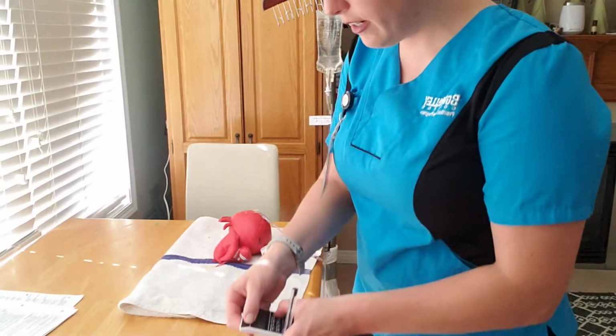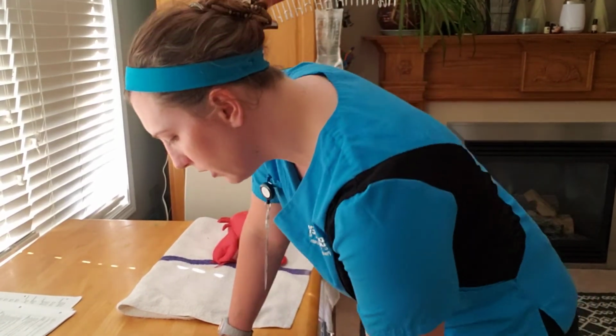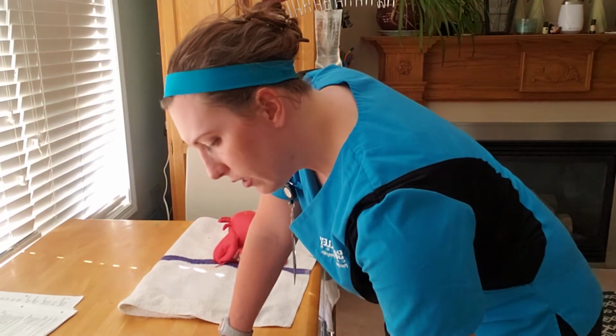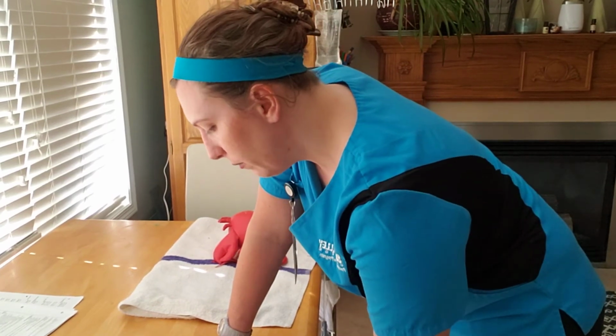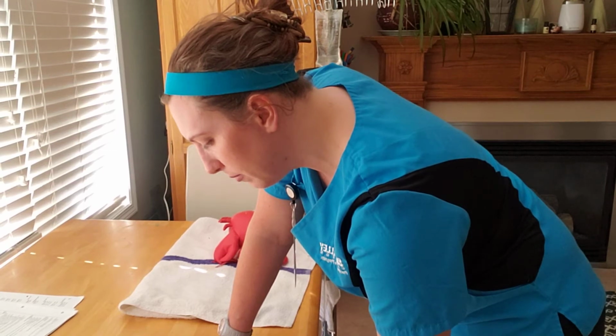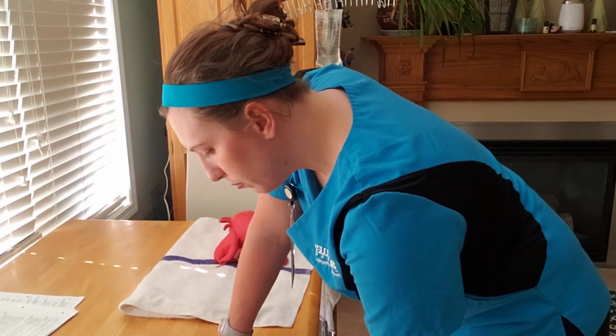Trusty calculator. 52 times 60 is 3,120. And then we're going to divide that by the total minutes we're going to infuse over, which is 20 minutes. Okay, so what we have here is our infusion rate of 156 milliliters per hour.